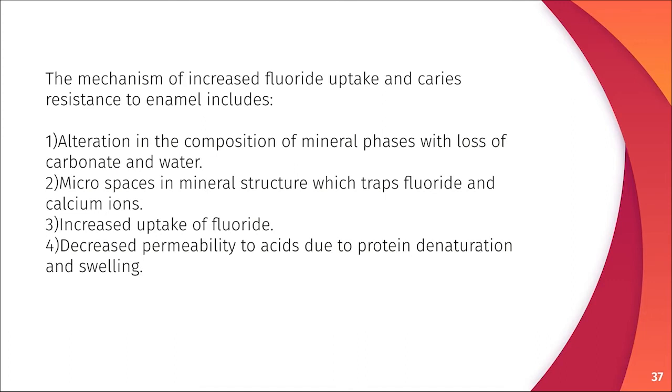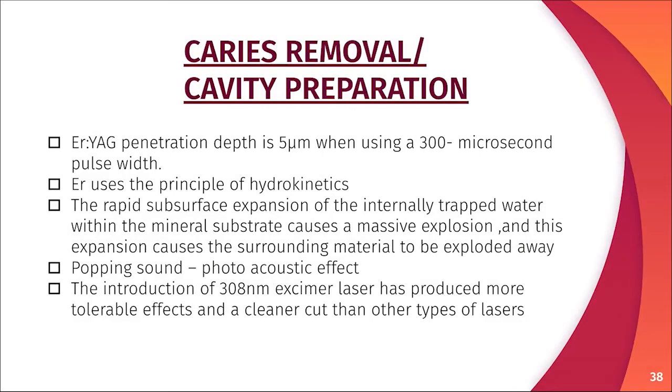Next, microspaces in mineral structures trap fluoride and calcium ions, thus increasing caries prevention. Increased uptake of fluoride, decreased permeability to acids due to protein denaturation and swelling.